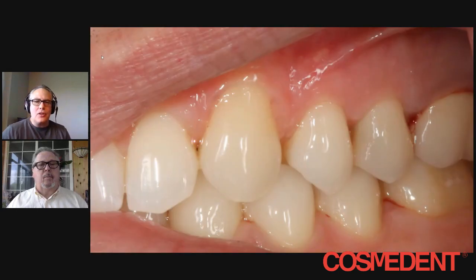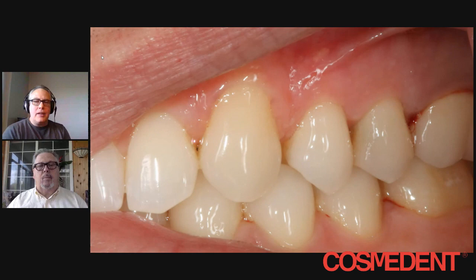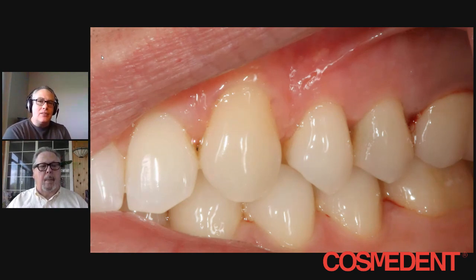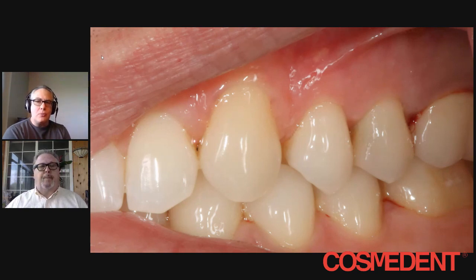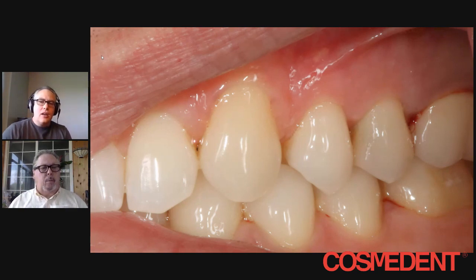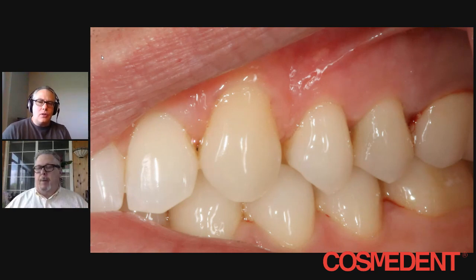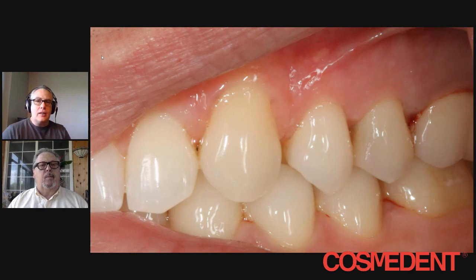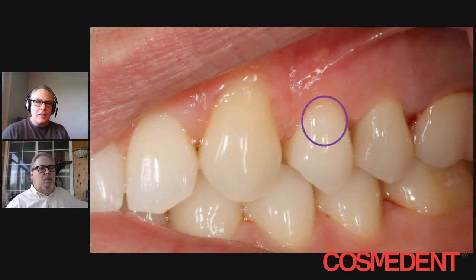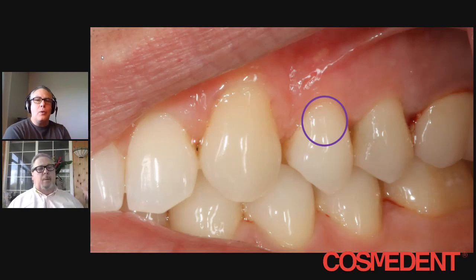When we have cervical composites and the patient is periodontally sound, often we can use direct composite as a predictable means to address cervical lesions, especially in cases of non-carious. In this picture I'm showing here, this is a case where a few teeth were restored using direct composite, and you can see some of the advantages of what we want to see in a successful outcome.